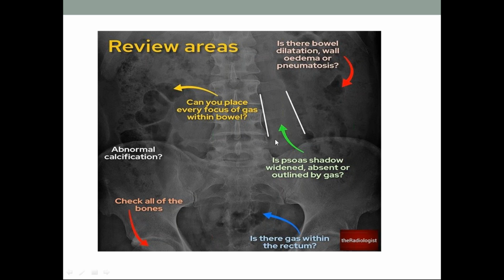Apart from this, there are pathological conditions that lead to obscuration of the shadows: hydronephrosis, polycystic kidney disease, ADPKD, and other renal conditions, and in some renal abscesses, pyelonephritis also, and then emphysematous pyelonephritis also. These will be obscured.